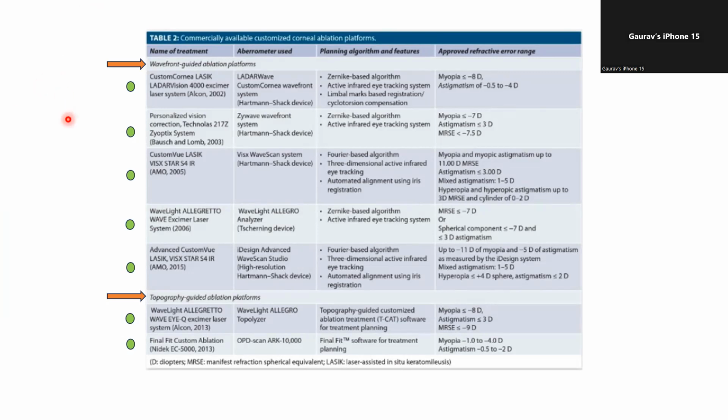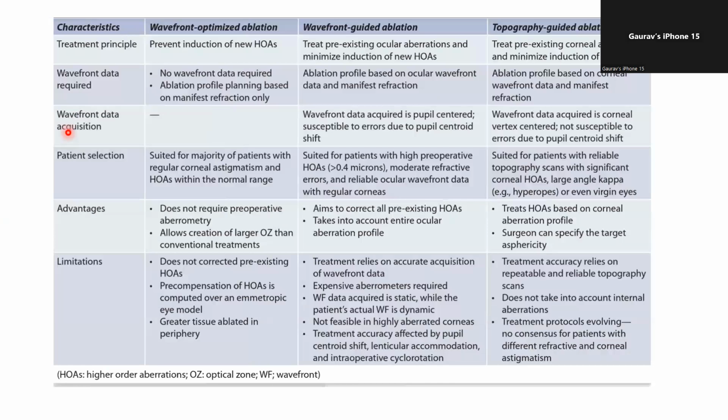How is aberrometry done? How do we do aberrometry when we are trying to do wavefront customized treatments, like wavefront guided treatments? How do we do the aberrometry actually?